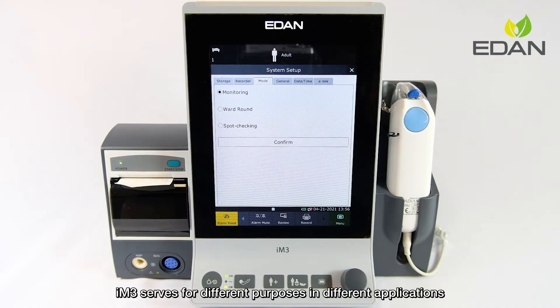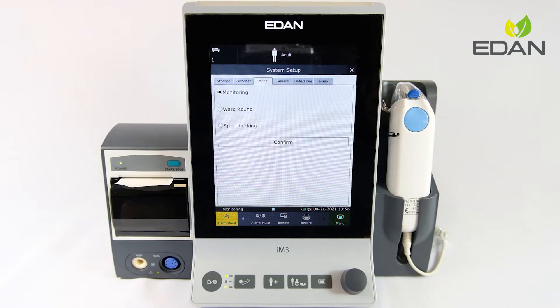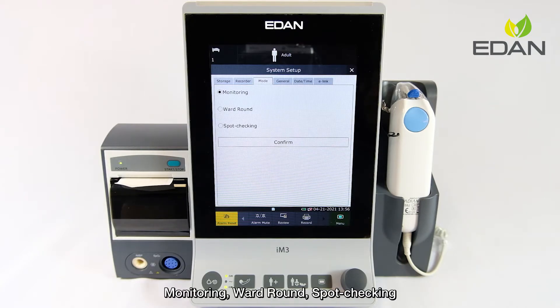The M3 serves different purposes in different applications. It provides three work modes: monitoring, ward round, and spot checking.